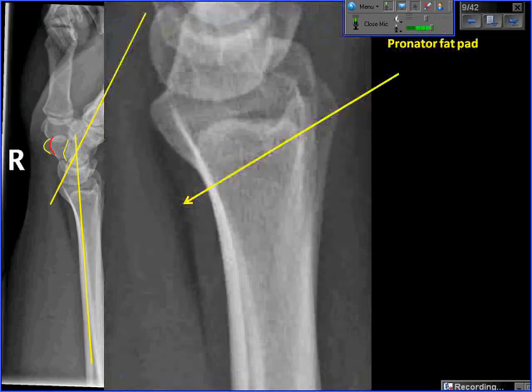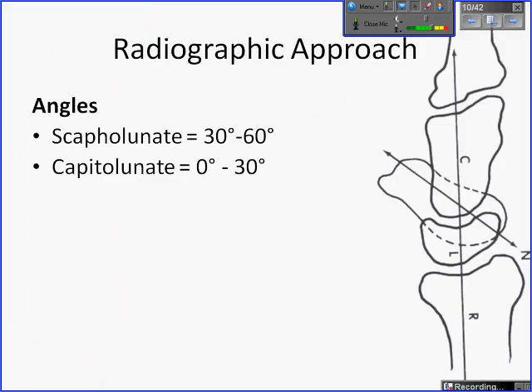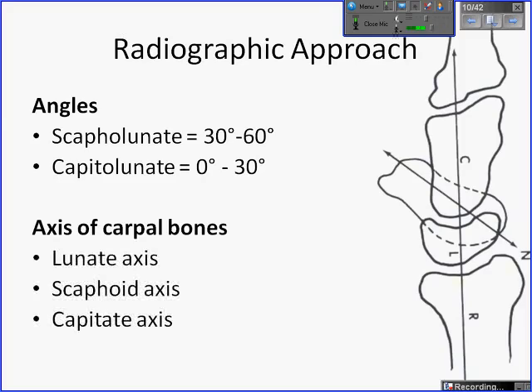On the lateral radiograph, two angles are of utmost importance: the scapholunate angle, which should be between 30 and 60 degrees, and the capitolunate angle, which should be between 0 and 30 degrees. To draw these angles, you need to properly draw the axes. The lunate axis is drawn by connecting the distal poles of the lunate and then drawing a perpendicular line. The scaphoid axis runs along the volar aspect of both the distal and proximal poles. For the capitate, you run a line straight through its body.